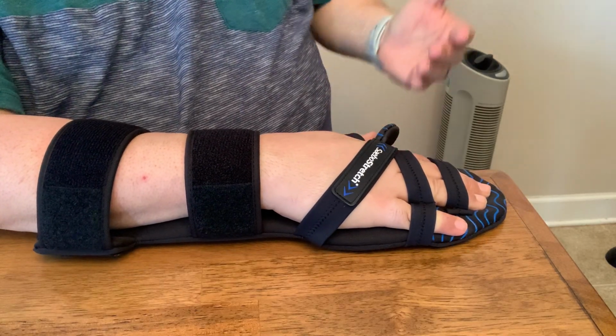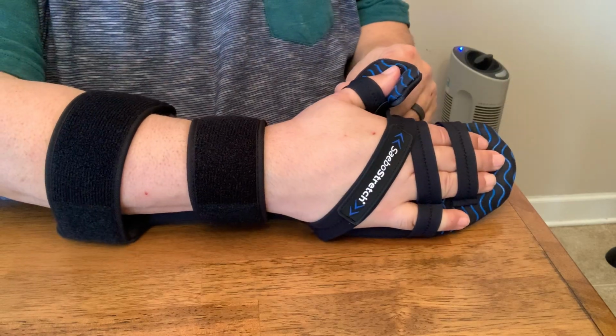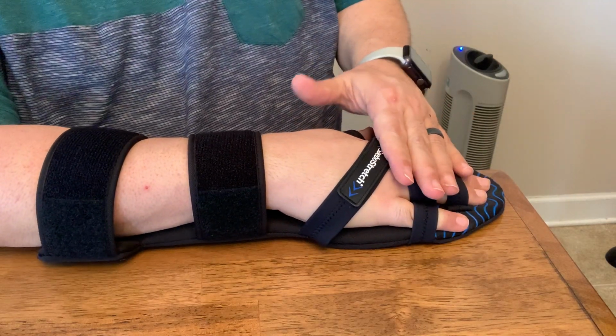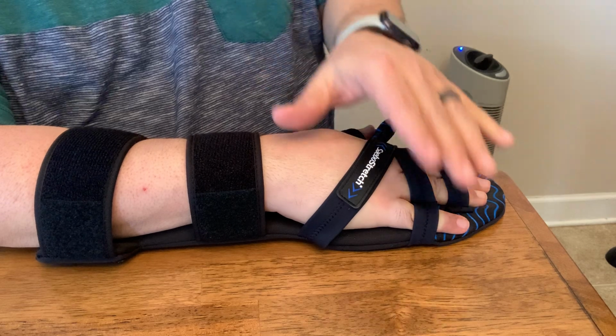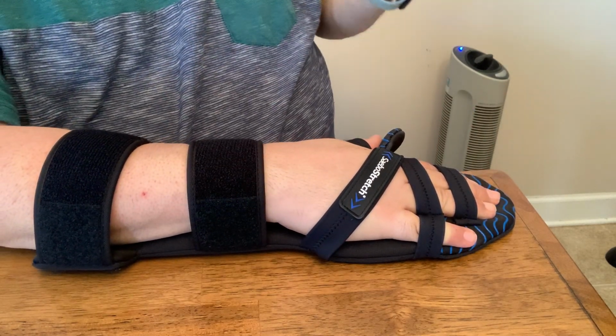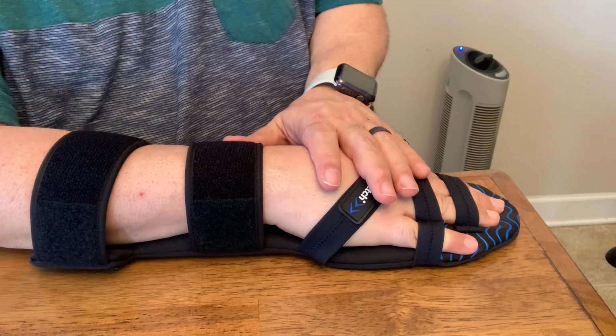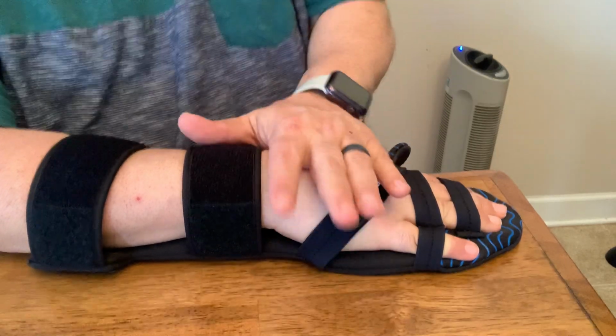But I am now in the SaeboStretch. I have my pinky where it needs to be. I've got my thumb secure. I've got my fingers straight. I've got the cross against my knuckles so my hand won't bend and curl up. I've got my arm straps. And that is how, by yourself, you put this on. It can be done. It does take time.